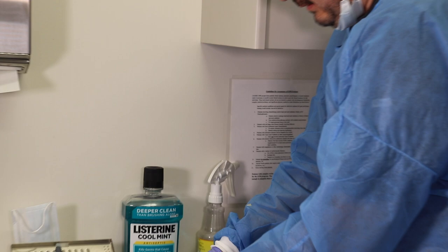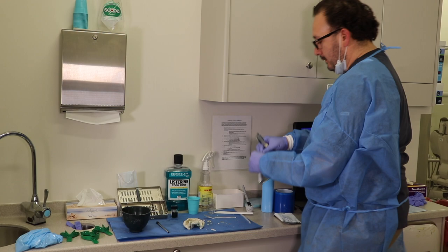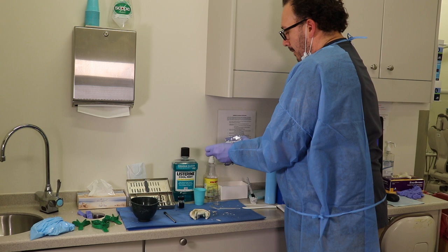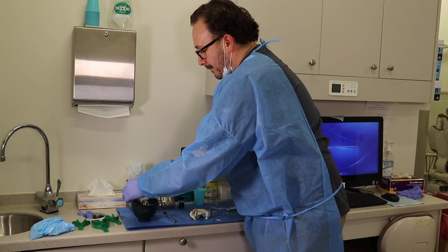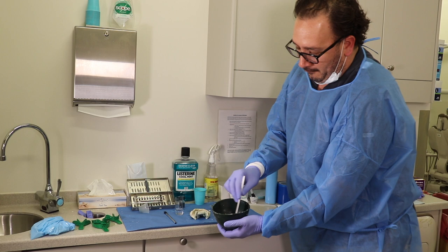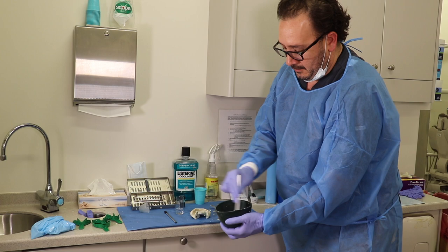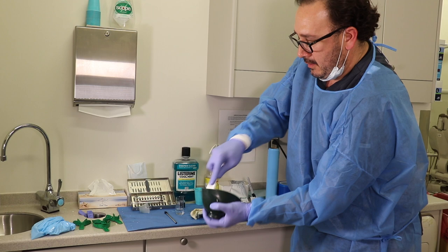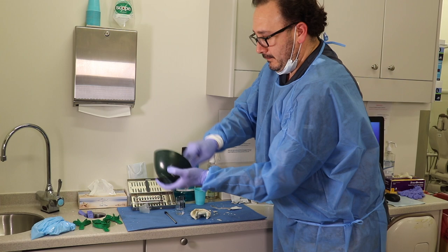I'm going to take a little bit of alginate, maybe about a scoop or two. And this one's not going to the patient's mouth, so I can kind of eyeball it. But I follow the same principle. I incorporate the water into the powder, and I go towards the walls. In this case, I didn't put as much water, and I'm getting a much thicker consistency of alginate. You'll see, it's almost as thick as you can play with it, you see?